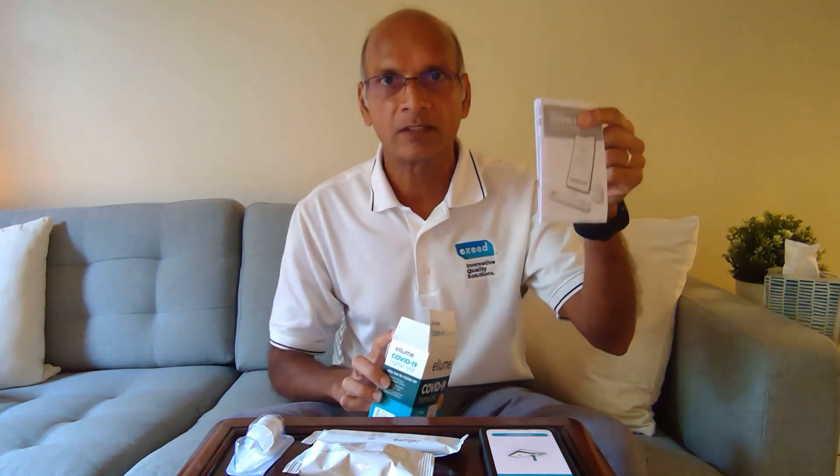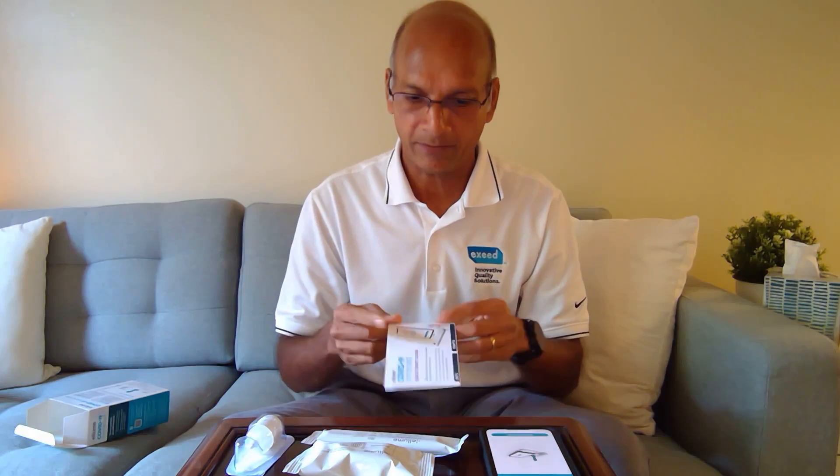We have a bunch of information here — let's set this aside. And we have a nice leaflet that looks pretty simple, a quick start guide with lots of pictures and easy instructions, which are also on the app. This is also very important — this is the reagent, and you can see it's sealed at the top. Do not open it yet. One thing to emphasize before you start: make sure you disinfect the working surface and wash your hands, which I have already done. So everything is clean.